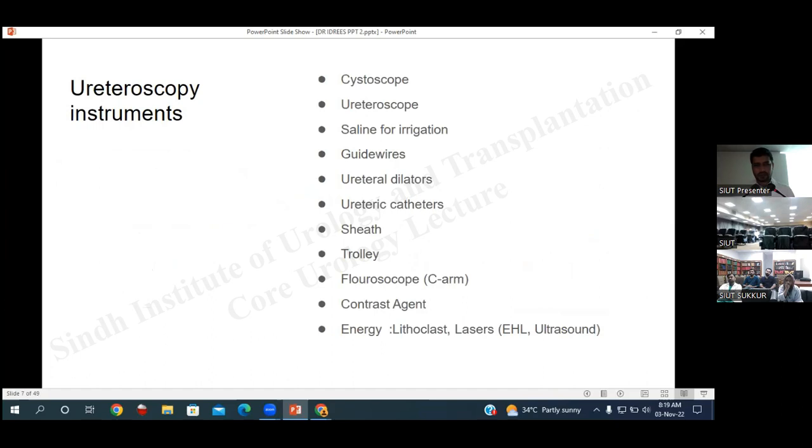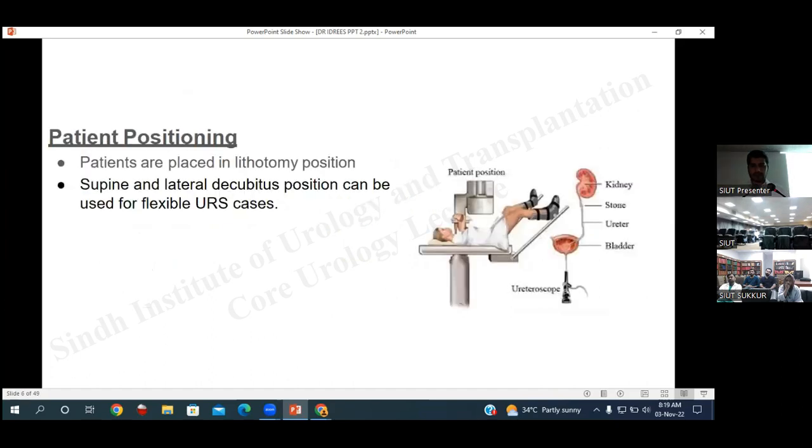Okay, now from Sakkar, Dr. Nazish and Dr. you are going to appear in the talks. Tell me, when you are going for URS, what will be present on your ureteroscopy table? Sir, fluoroscope, and along with that, the ureterorenoscope, flexible if possible. What is going to be on the instrument table, and why a flexible URS in the first account?